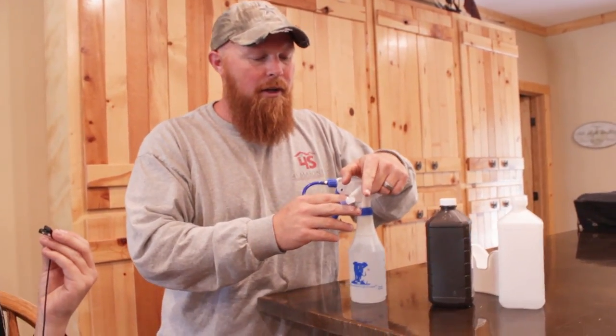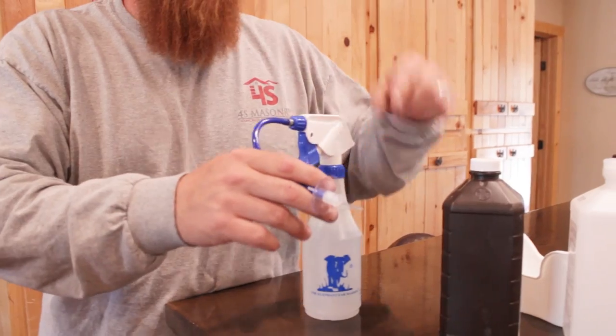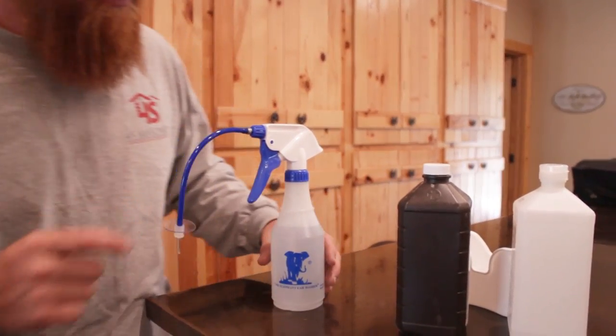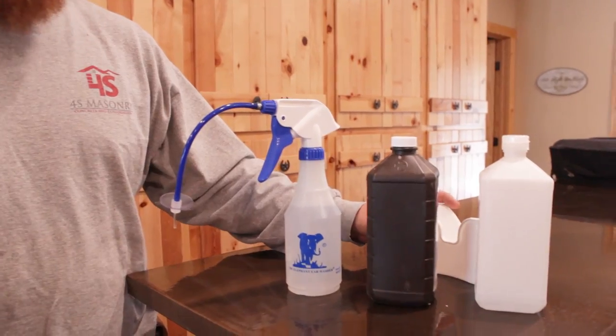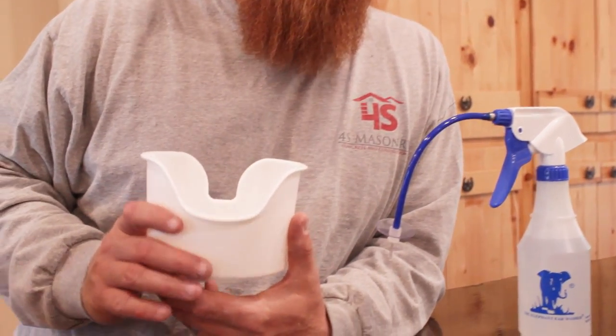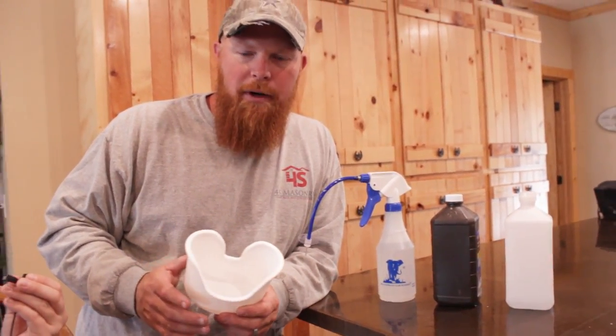It just flushes — that's what it does. It's got a small little tip and when you squeeze it, all it does is shoot it out. It creates manufactured pressure. This came with it as well. I bought the whole kit — it was probably about 40 bucks altogether for these two together. You can get it on Amazon or whatever.